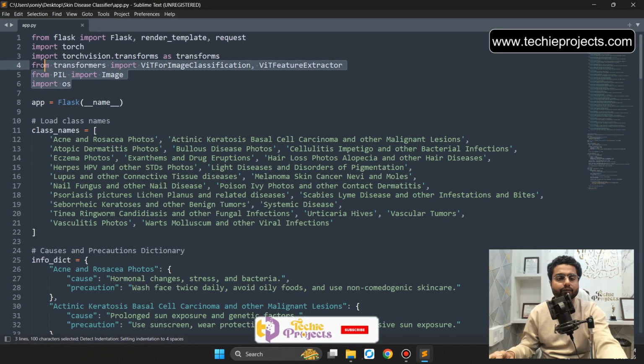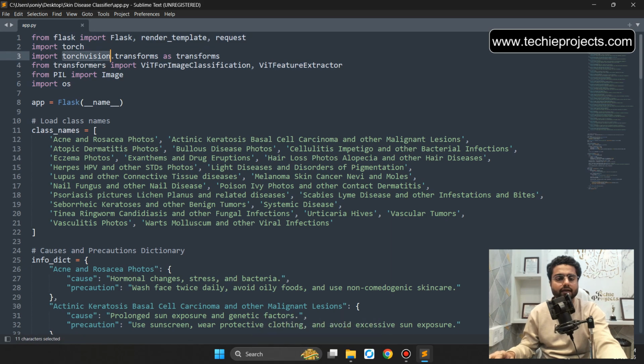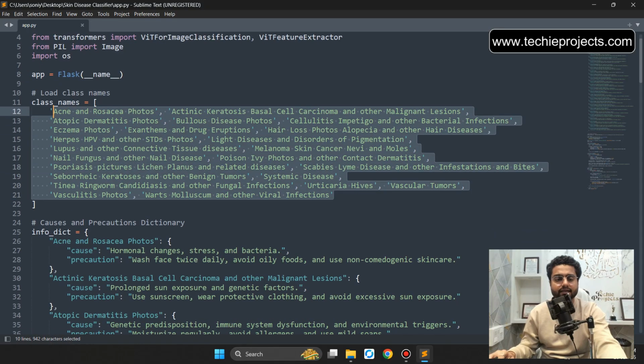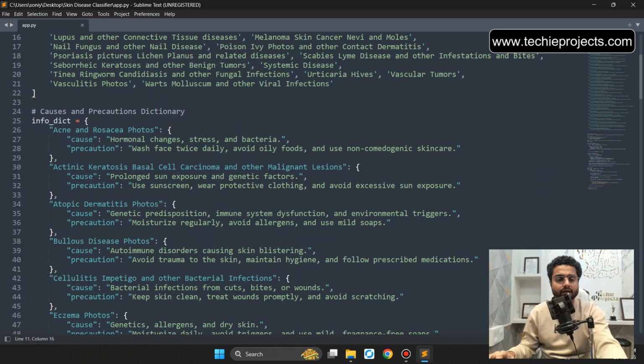Now in the starting, we are importing the libraries like Flask, Torch, Torchvision, Transformers, ViT for image classification, and ViT feature extractor, Pillow library, and OS. And we are using Flask for creating the graphical user interface. And those are the classes for skin disease, the causes and precaution dictionary.